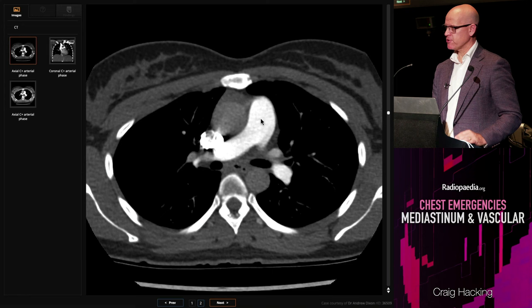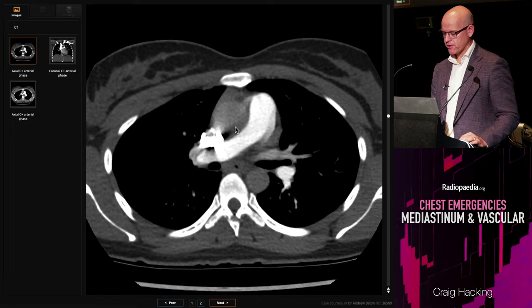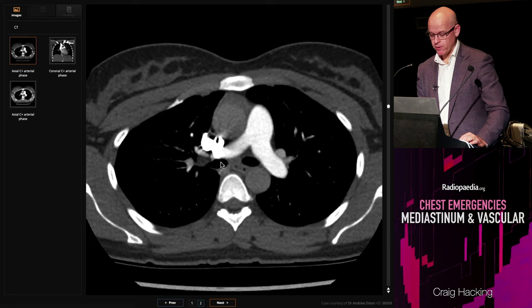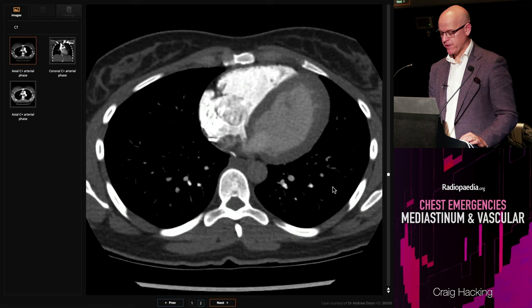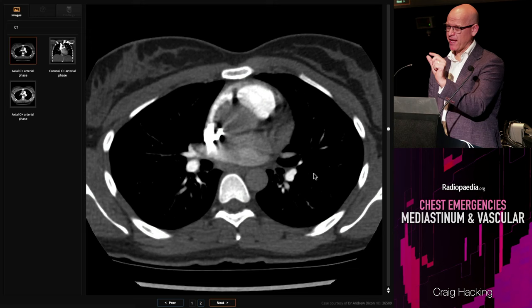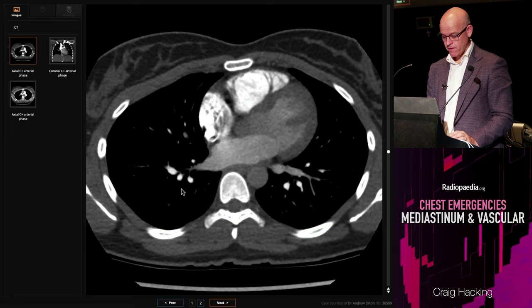This is a nice CTPA where we have obvious opacification primarily of the pulmonary trunk and the arteries, so the right-sided circulation, and the aorta is not opacified. What we're looking for are filling defects, and you've got to follow all these arteries out to the periphery. We want to make sure the arteries are well opacified because you do need to pick up little small ones out in the periphery — they can be subtle.